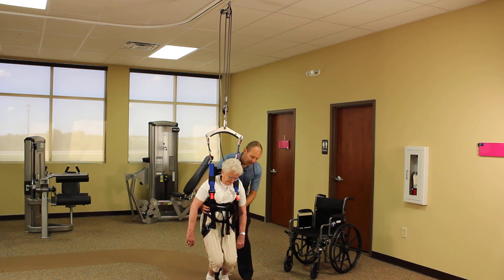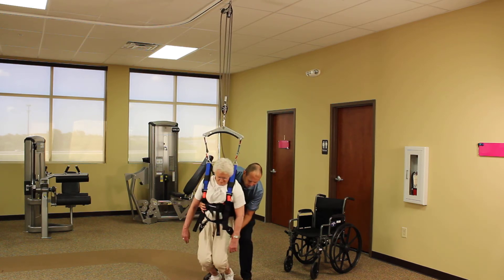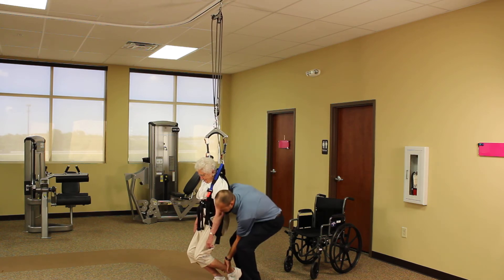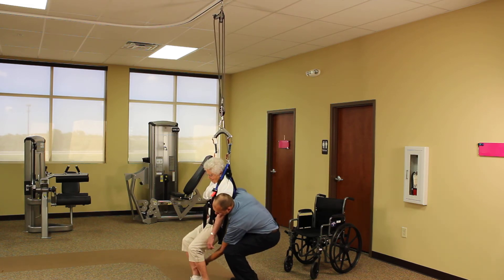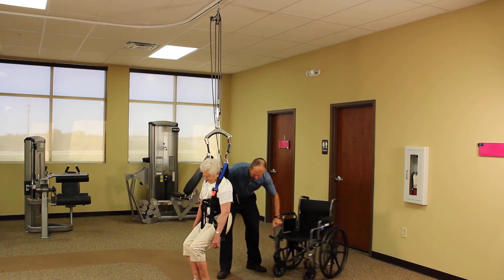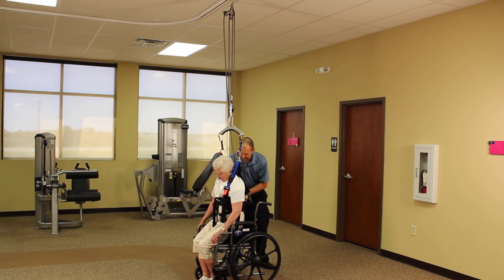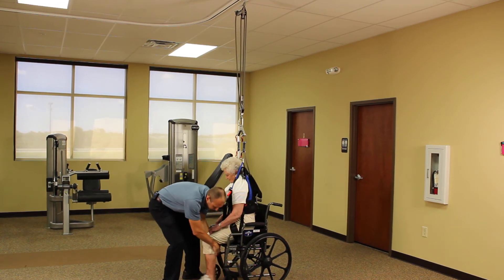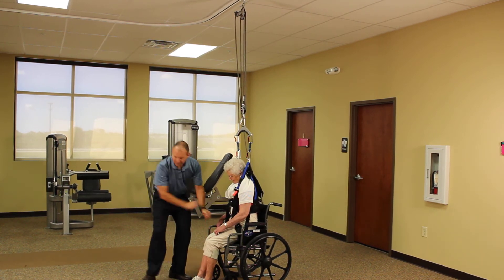Another thing you can do if you find yourself by yourself is we're going to turn the patient so they're perpendicular to the rail. The rail is running this way. I'm going to move the legs out here in front and we're going to bring the chair up underneath the patient. You can move those legs a little farther out like that so they'll force them to go backwards.